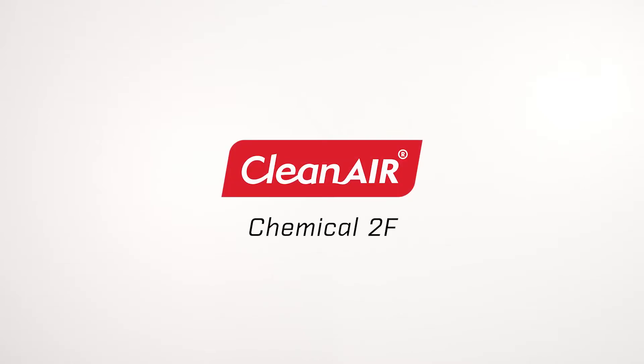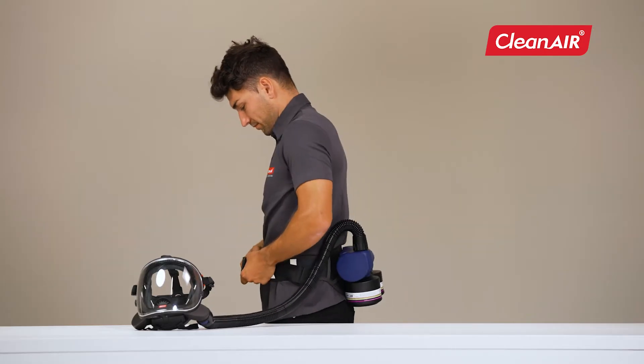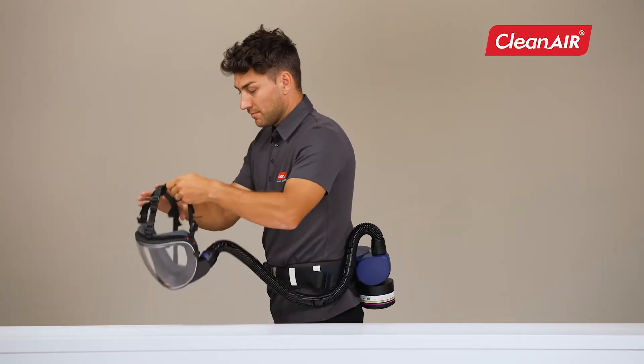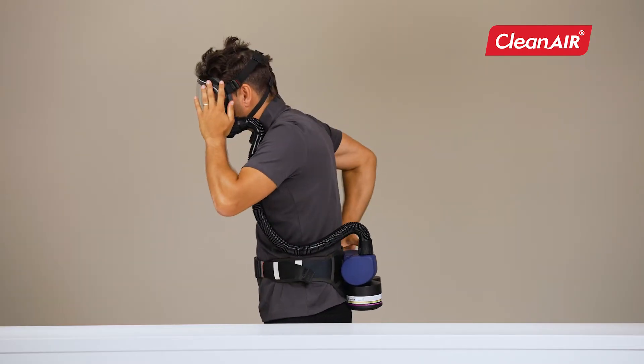Clean Air introduces Chemical 2F, a compact, lightweight, yet powerful powered air purifying respirator that, in combination with an appropriate head top, offers the highest respiratory protection.